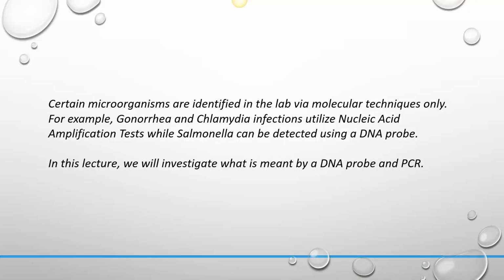Certain microorganisms are identified in the lab via molecular techniques only. For example, gonorrhea and chlamydia infections utilize nucleic acid amplification tests, while salmonella can be detected using a DNA probe. In this lecture, we're going to investigate what is meant by a DNA probe and PCR.